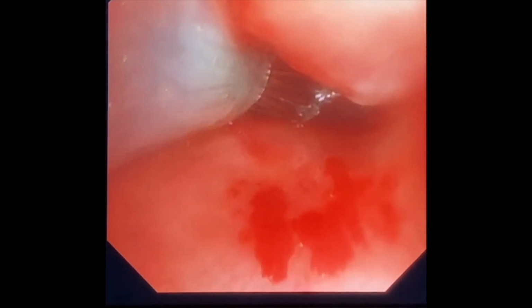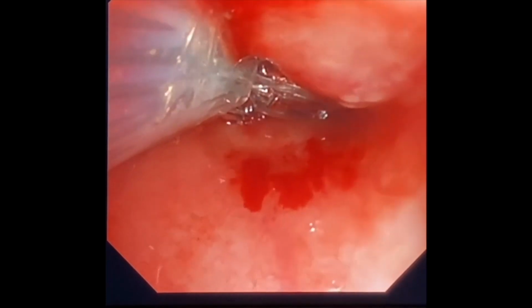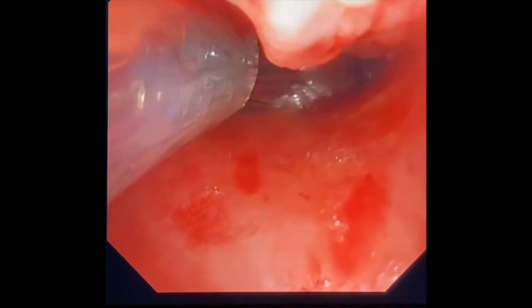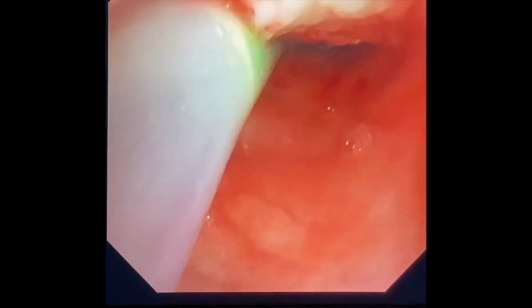The bronchoscopist then follows and retreats as the stent opens up. We perform airway stent insertion with a direct vision method like this to ensure that we have placed the stent as accurately as possible across the stricture.